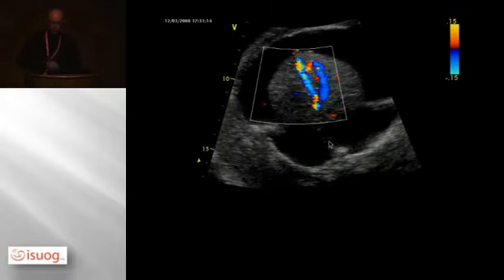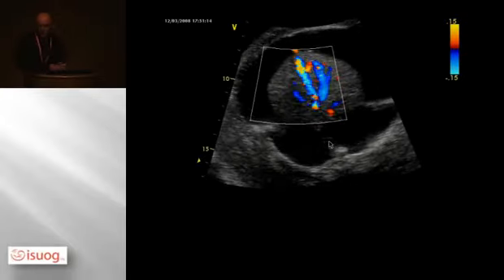And the reason for it all is this. Can anybody make the diagnosis? Shunt. It's an intrahepatic portosystemic shunt. This is the umbilical vein. There is a shunt directly to the median liver vein, and that takes out the pressure, reduces the liver, kills the baby at the end.